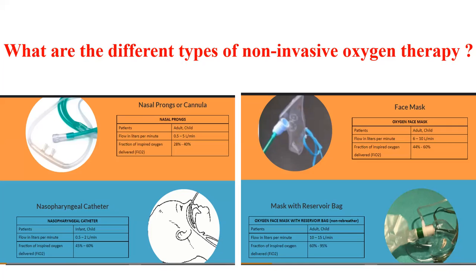Yes, that's the nasal cannula, with a flow of 1 to 5 liters, which is not high flow. Yes, it's right, and the patient is comfortable. He can speak, he can express himself, he can eat, he can drink. And humidification of air is not required.